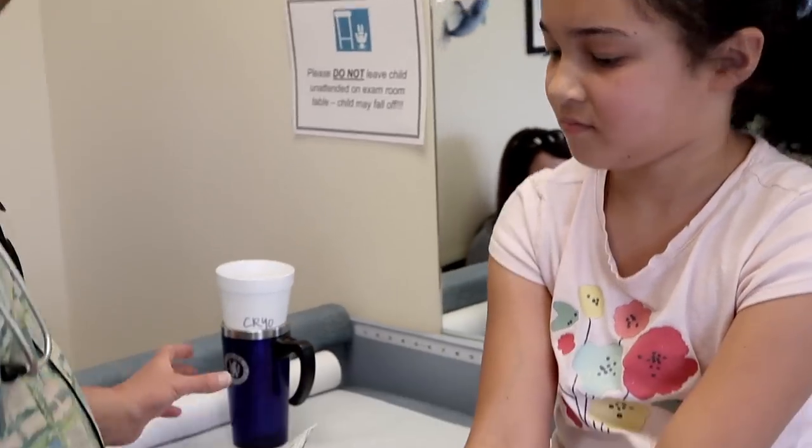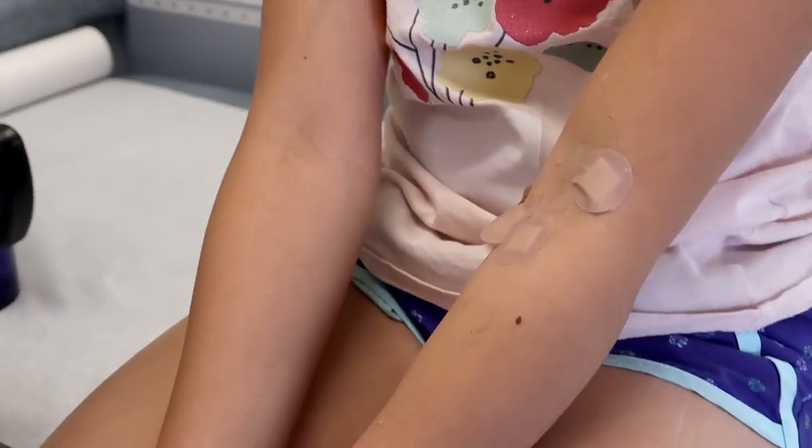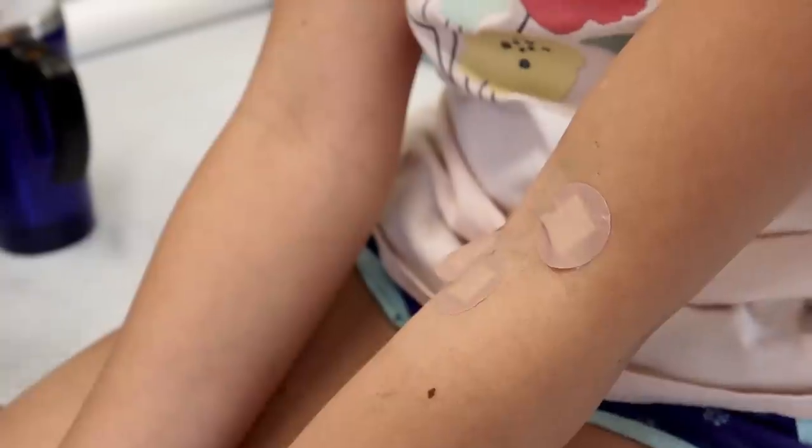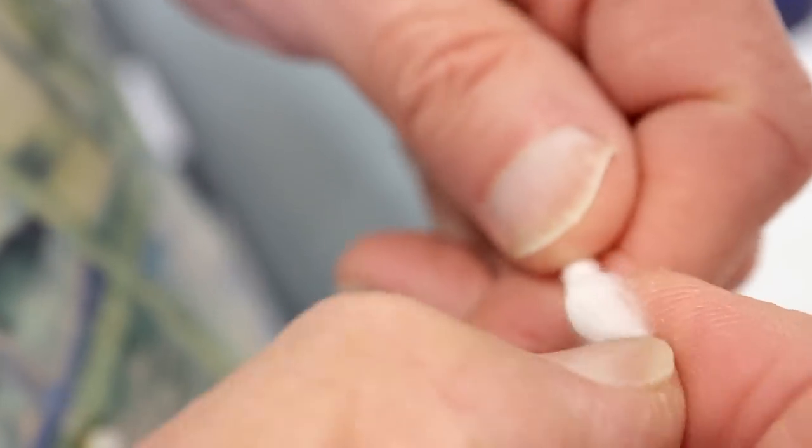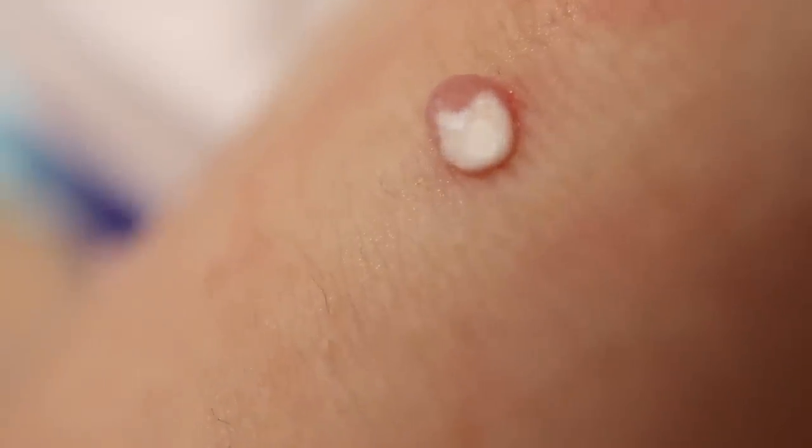So what I gotta do here is get a little q-tip and we're gonna loosen up the end of it here. It holds a little more of that liquid nitrogen. And then we'll just get a little... See how it turns a little white?